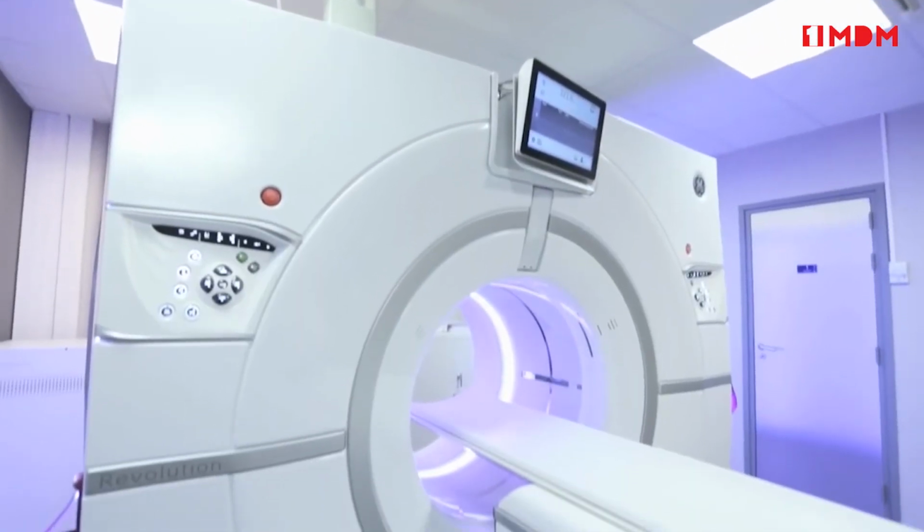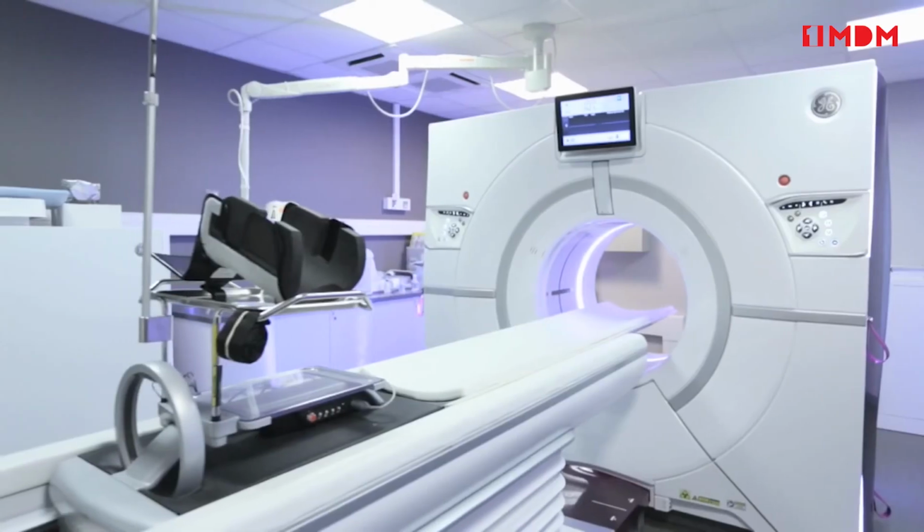Improved robustness, better image quality, and lower dose are the main benefits of this revolutionary system. Cardiac CT becomes more and more the first-line exam in the evaluation of ischemic cardiopathy.